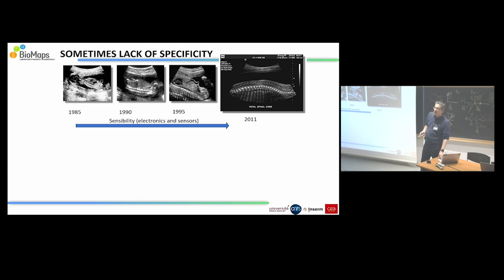Yes? So that's in the case that you have a resolution that is superior to the dimension of the blood vessel. For example, suppose that you want to know if the liver of somebody is well perfused. In that case, if I remember correctly, the resolution, since you look deep into tissue, will not be enough. So you will get a distribution of velocities toward the probe, away from the probe, and so on, and therefore a distribution of different frequencies, some higher and some lower. I suppose that you can reconstruct a perfusion also from this distribution.